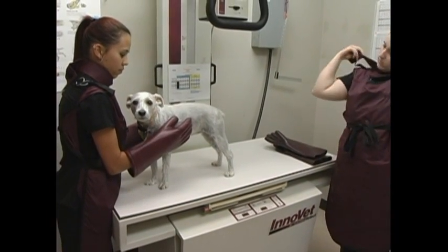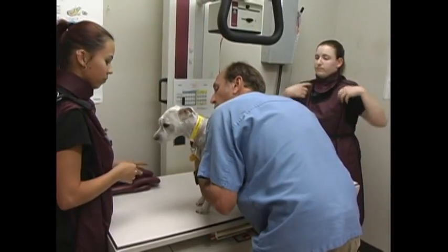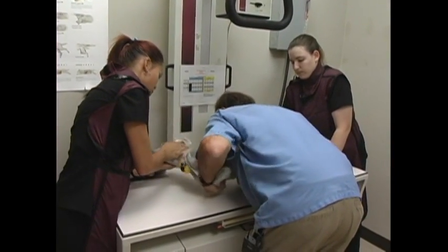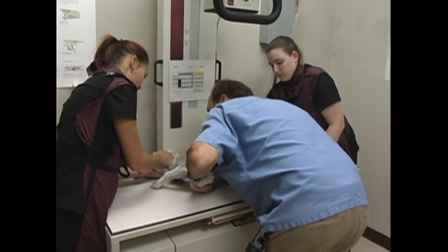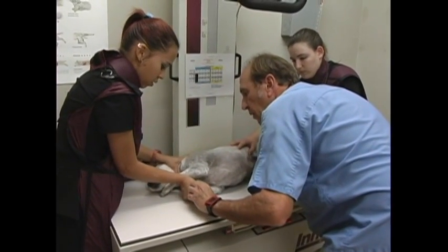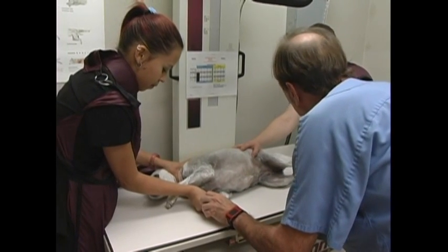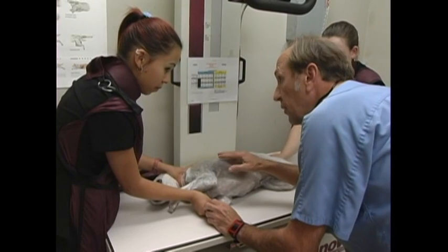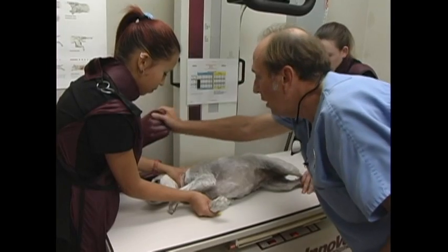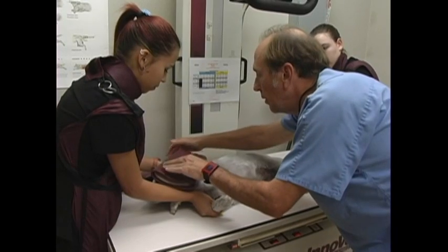So here's the fun part, and Isabel's going to be asked to get on her side to take a lateral view. Okay, you're going to hold steady the head. Go very slow, very gentle. Now with one hand you hold the head down, with the other hand you hold the leg down, all right? Okay, now very good. Keep them relaxed, right? You have to use your voice. You have to be very calm. Use your voice. The good Lord gave you a voice to use. Now sometimes when you have to use your hands, you cover them up like this. That's another way to do that. Okay, just be calm.